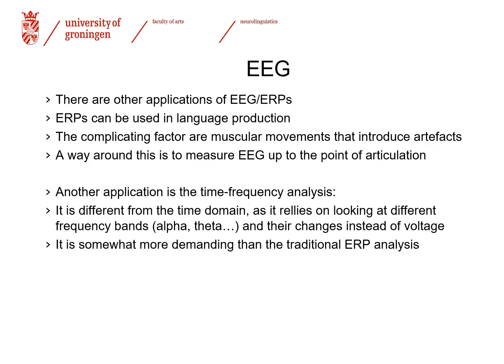The nice thing is that most of the time, the time frequency analysis is compatible with the ERP analysis, so both can be done in one go. However, as you've already seen, it's almost a full hour, and we only managed to talk about event-related potentials, and there are so many more things that I would like to share with you. So introducing the time frequency analysis would have been too much. So maybe some other time.